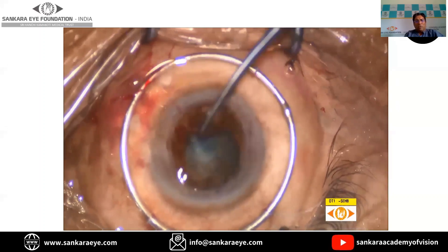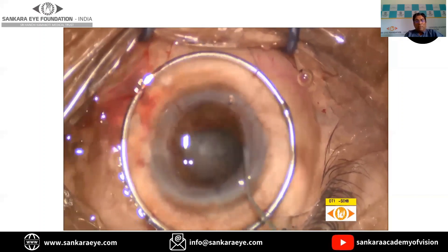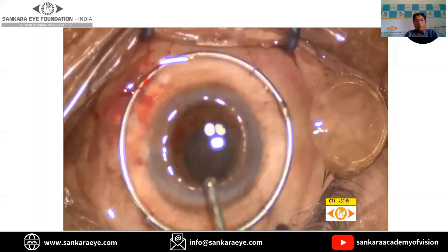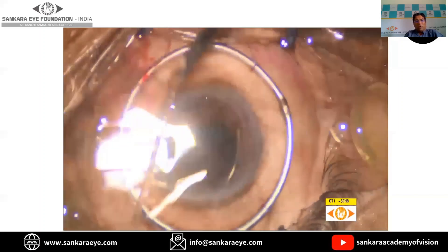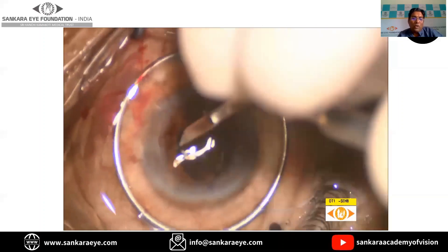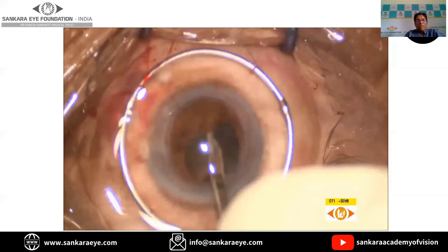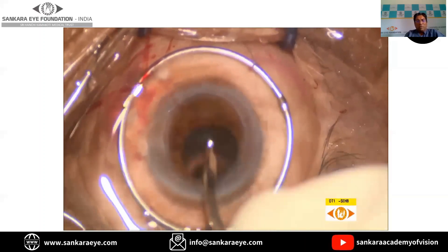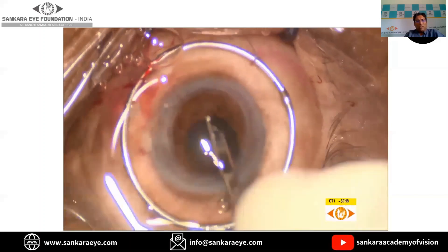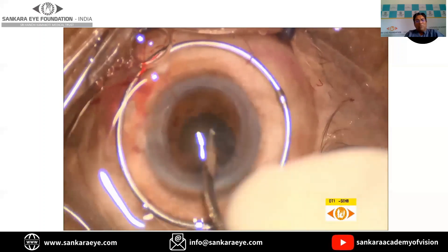It is important to note that this is an open-sky procedure, so there can be chances of severe vitreous upthrust. It is very important to be very gentle when doing the surgery, especially during cortical wash, which has to be done very gently because there can be frequent vitreous upthrust. Care is taken to remove all the cortex from the eye, making sure there is no residual cortex, as that can lead to further inflammation.